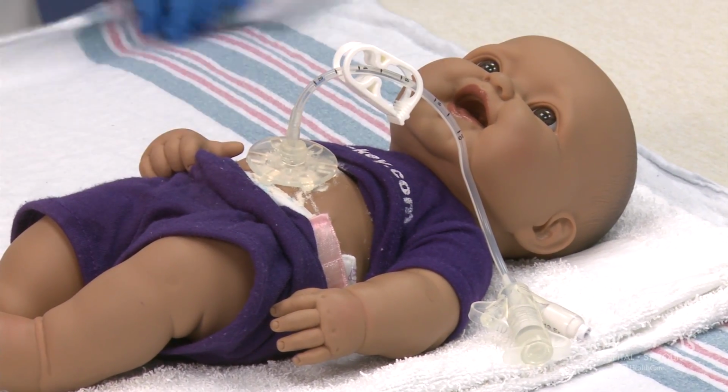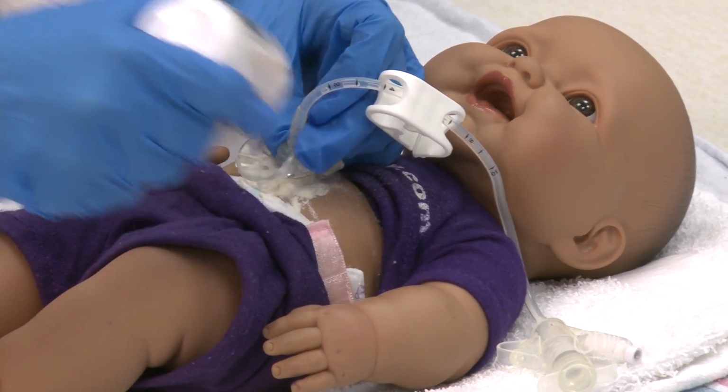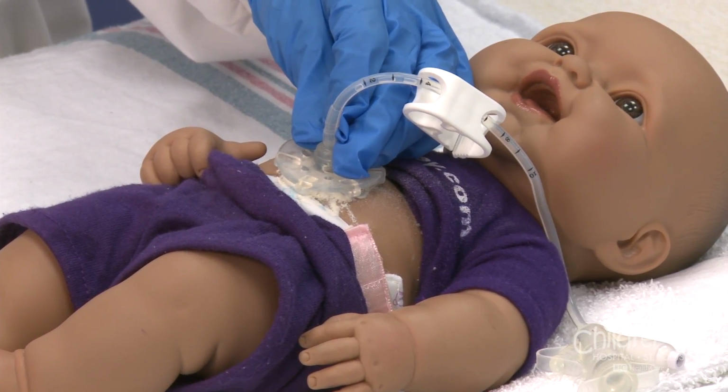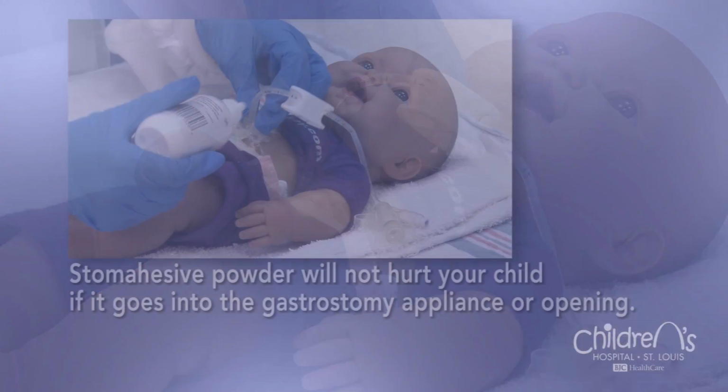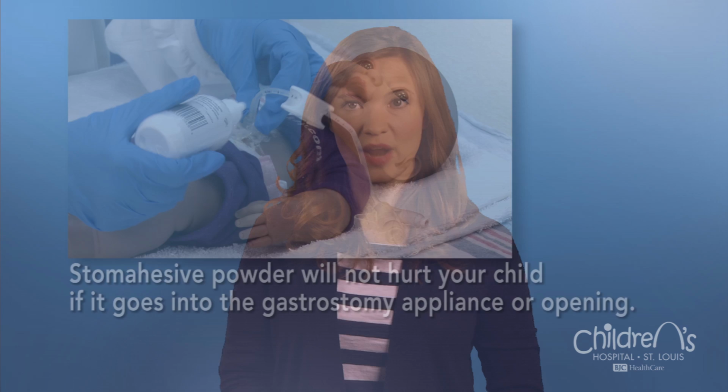Sprinkle stomahesive powder around the gastrostomy daily after bathing your child. You may also use a piece of gauze over the powder to absorb additional leakage. Stomahesive powder can be sprinkled around the tube and will not hurt your child if some of the powder goes into the gastrostomy appliance or stoma site. Moisture may cause a rash. If the bumps or rash do not clear up after using stomahesive powder, call the surgery office. There are other dressings available to help with irritation. Call the general surgery office for advice on other products that can be used.